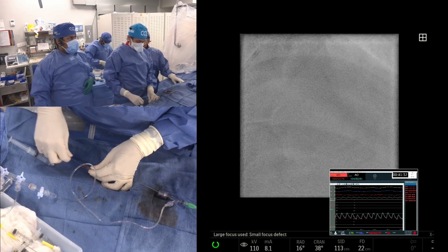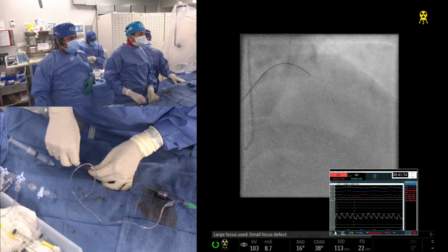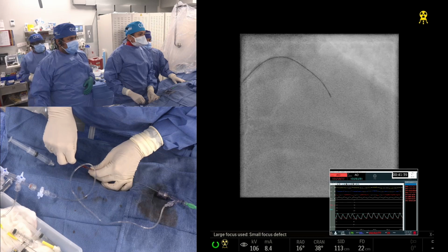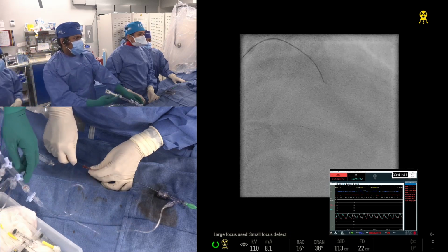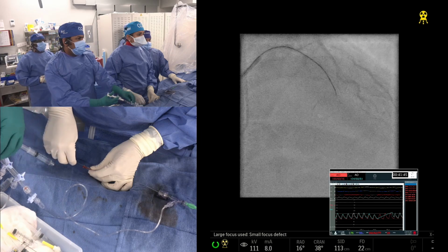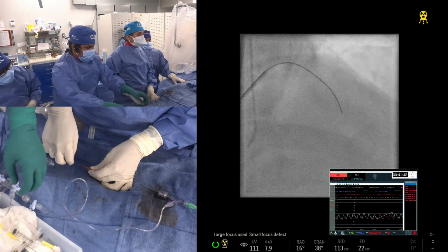Yes, the wire escalations you're doing are all illustrated in the app. That would be another useful adjunct if people want to do it. Get hold of the CTO app and follow the retro case along. Guide wire app.